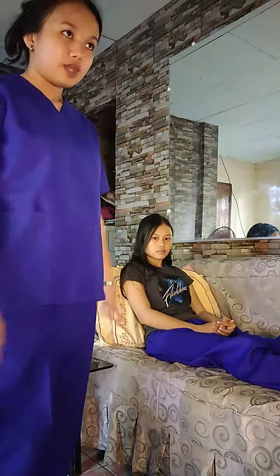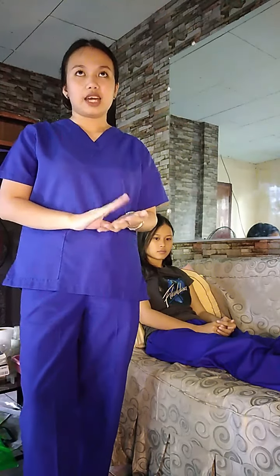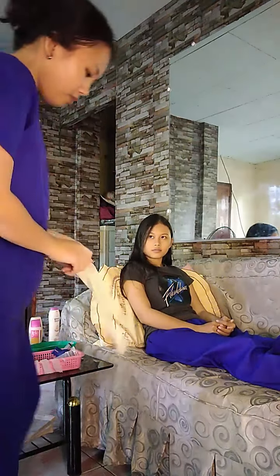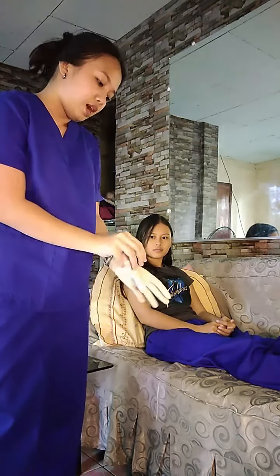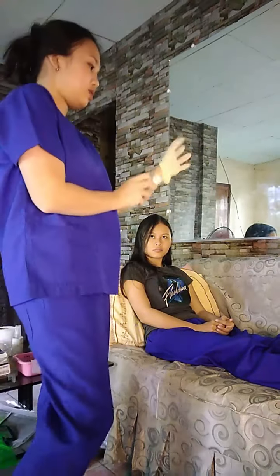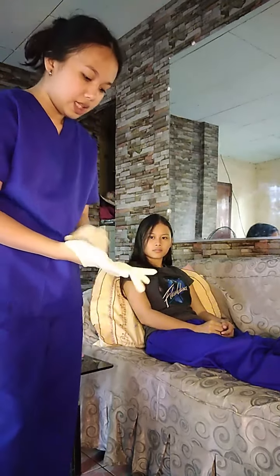So, assuming that I have prepared the equipments, I will wash my hands and then perform hand hygiene and then wear gloves. So, assuming that I have washed my hand, I will proceed to wearing gloves. So, this procedure can be sterile and then it can be clean. It depends on the facility. So, I have worn my gloves. I'm performing this procedure in a clean technique.